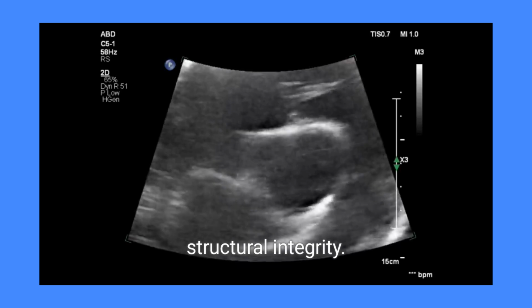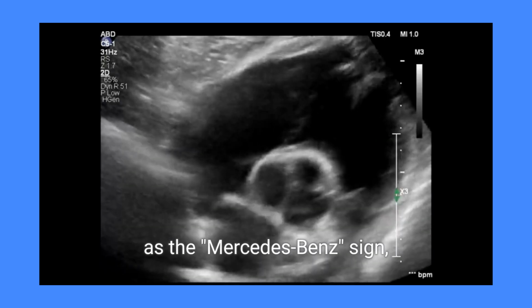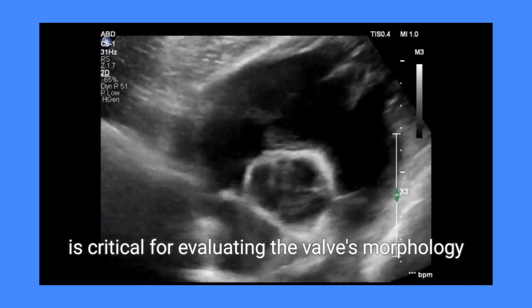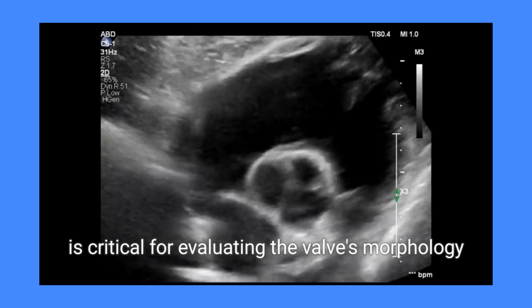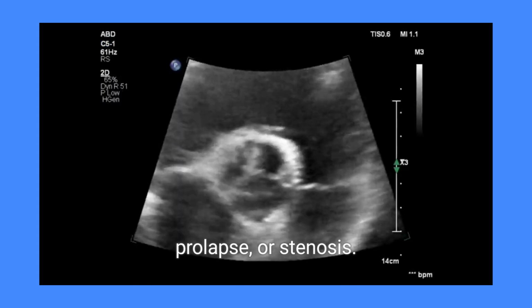This view, often referred to as the Mercedes-Benz sign, is critical for evaluating the valve's morphology and detecting abnormalities like calcification, prolapse, or stenosis.